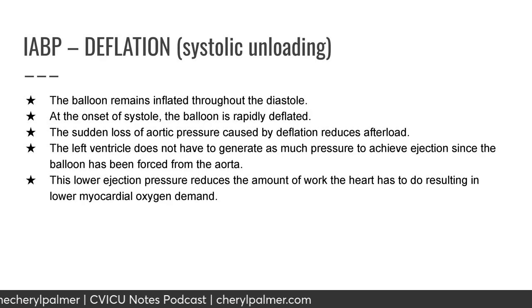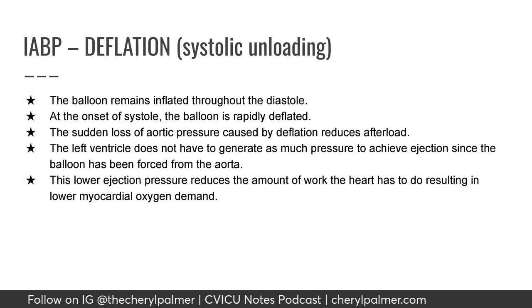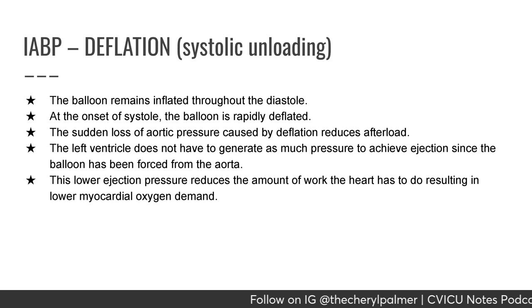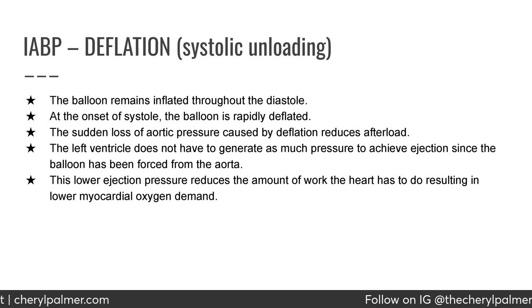Balloon deflation, which is systolic unloading. The balloon remains inflated throughout the diastole. At the onset of systole, the balloon is rapidly deflated. The sudden loss of aortic pressure caused by the deflation reduces afterload. The left ventricle does not have to generate as much pressure to achieve ejection since the blood has been displaced from the aorta. This lower ejection pressure reduces the amount of work the heart has to do, resulting in lower myocardial oxygen demand.